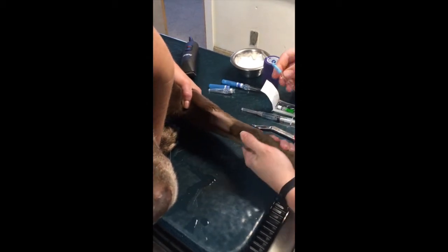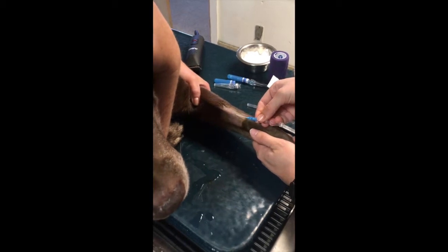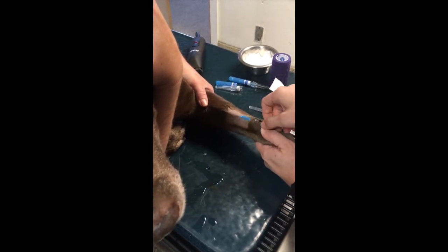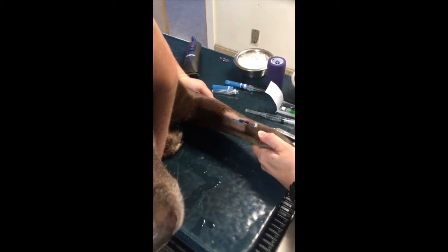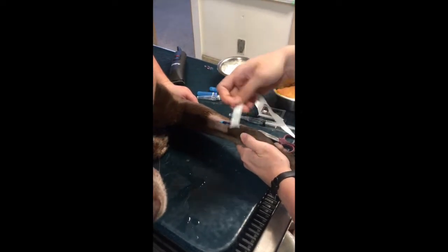So now that I have that nice and uncapped, I want to make sure that the bevel side is up, and I'm going to go ahead and insert the catheter. Once I have a flash in my stylet, I'm going to advance the catheter. I'm going to quickly transfer that, make sure my sharps are out of the field, and then I am going to secure my catheter with tape.